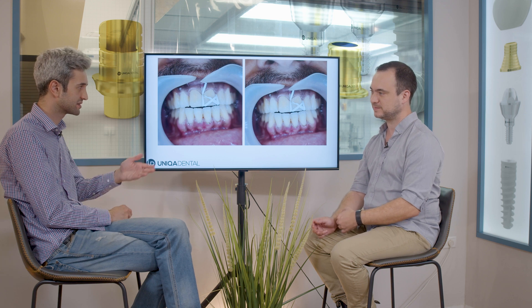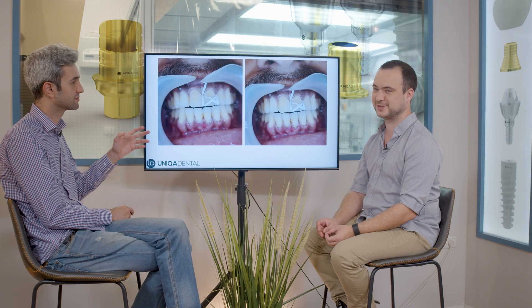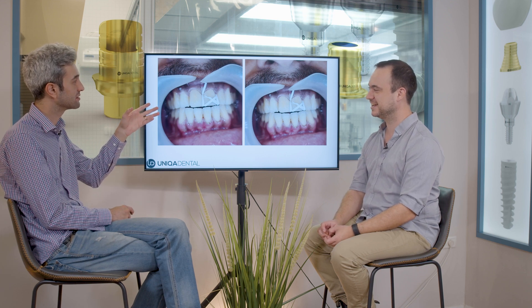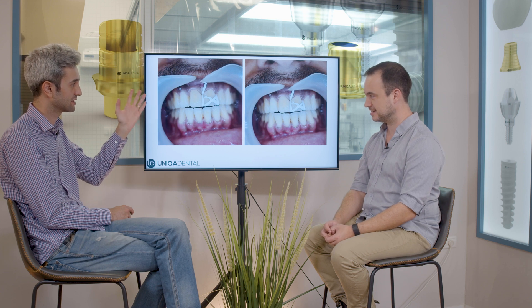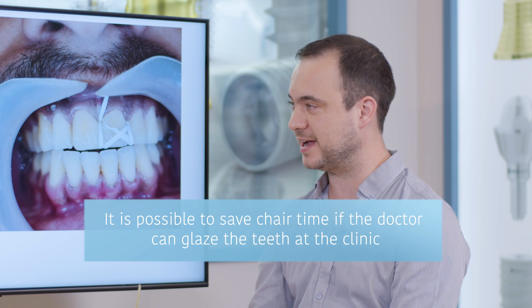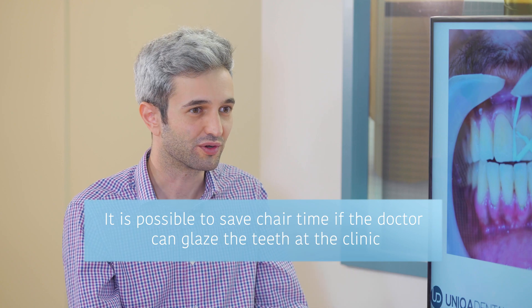So it's something that doctors know how to do — you don't need special training. There are of course courses; every company has its own courses on how you apply glaze on crowns and what techniques to use. You can even see it on YouTube. Keeping this glaze coloring procedure in-clinic is just more comfortable. In the end, it saves time and you get the best results you want, because you do it on the fly. This is the end result.